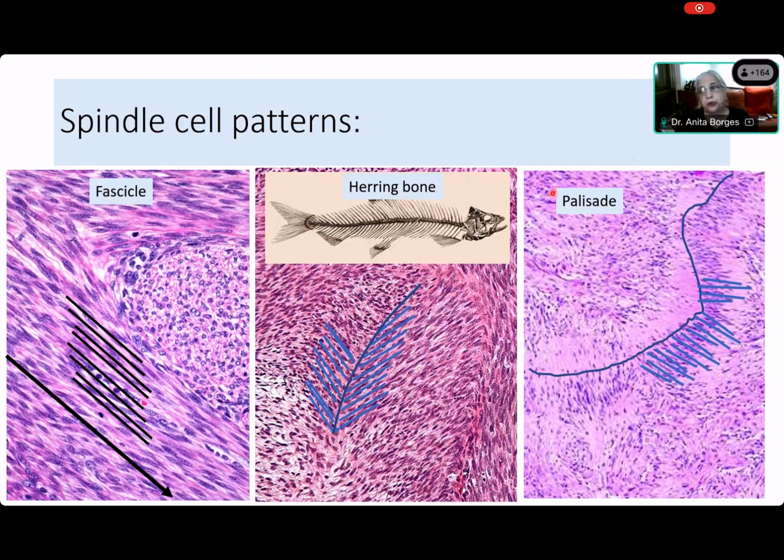So what do you need for a palisade, Elsa? Are the basal cells, are they spindle cells, Elsa? Are they spindle cells? No, ma'am. Yes or no? No, ma'am. Very good. So they're not spindle cells, and yet we see palisading. Why? So the palisade is not something that you only see in spindle cells. Okay. What do you require? What is the minimum requirement for a palisade?